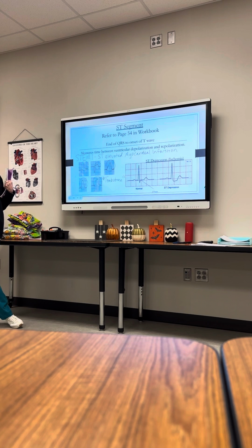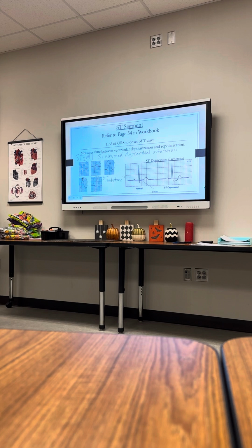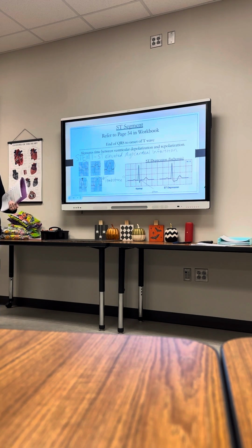Not necessarily, but maybe we're headed there if we don't take action. I think this one looks the most like why we would call it. It kind of looks like a tombstone. So if that helps you lock it in.